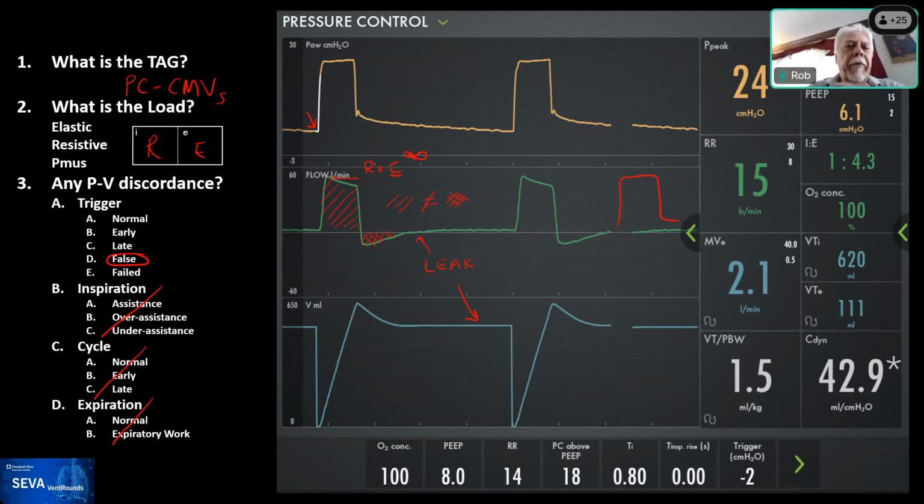Yeah, this is just like ventilating a preemie with an uncuffed tube with a high frequency jet ventilator, and there's no consideration whatsoever for tidal volumes. You do it all, like you say, by auscultation and by looking at chest movement. Yeah. So the tidal volume in a leak this large becomes absolutely unreliable, and that's an important thing for us to recognize.